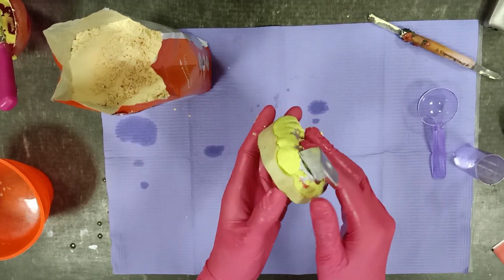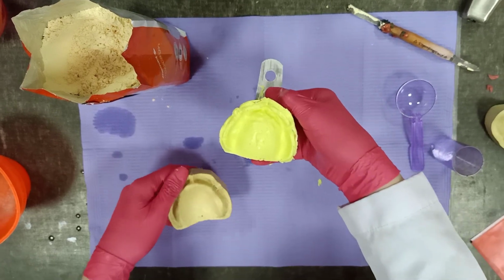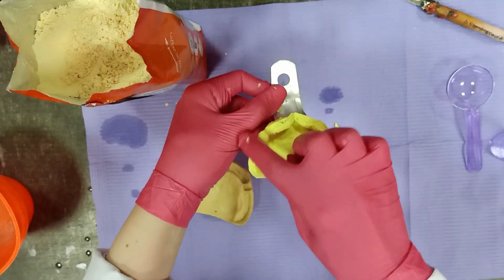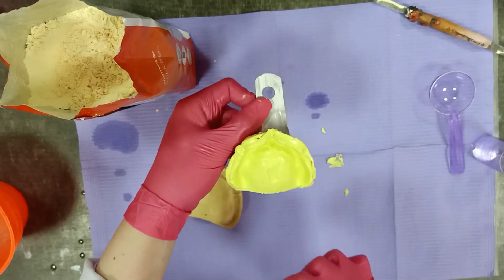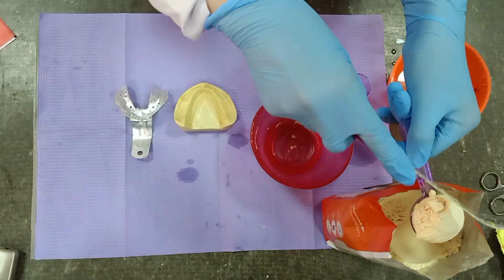And now we are ready to remove it from the cast. As you can see, all the borders are present. The excess amount outside can be removed using a carver or a knife. And we have to set it aside.